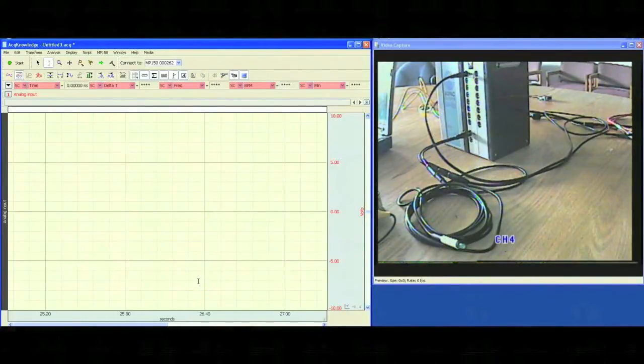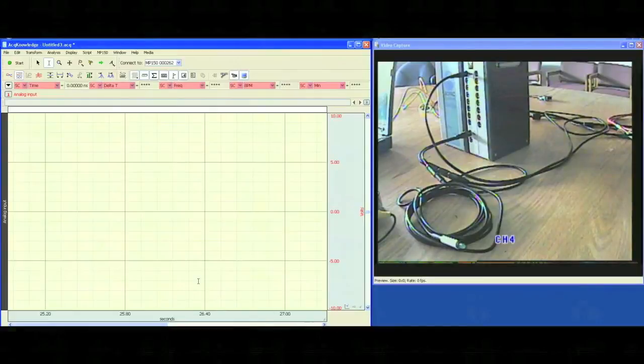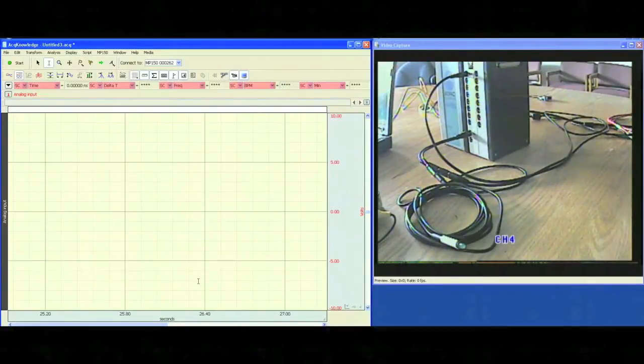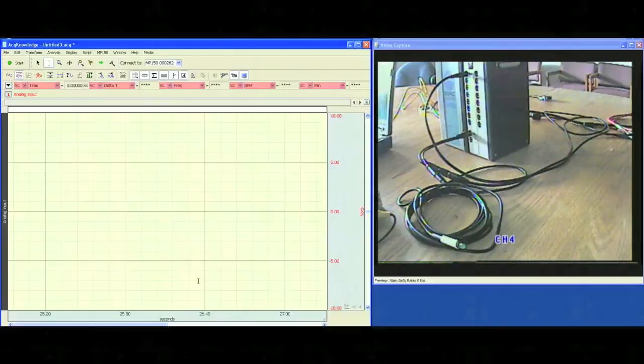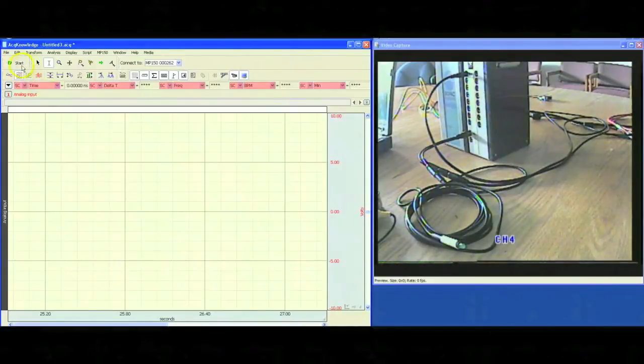From here, we can see if there is any delay between when the light is flashing and when the pulse is showing on our video screen. We can then take that and enter it into our offset. I'll show you how that's done right now.